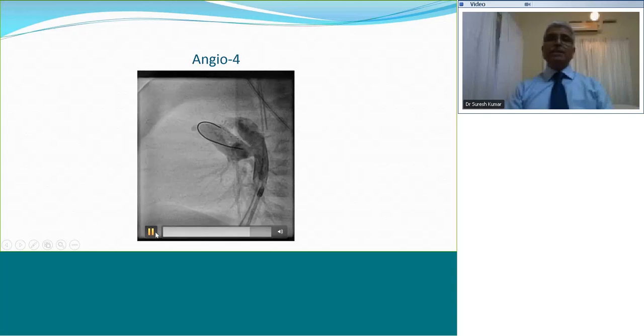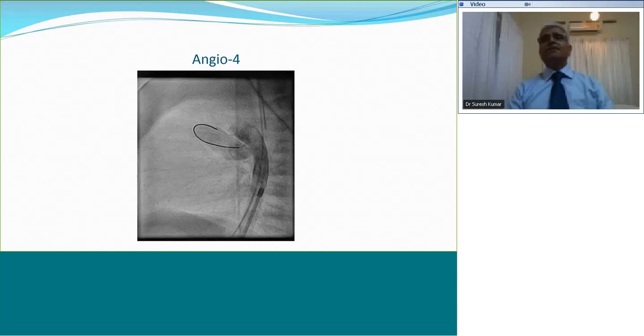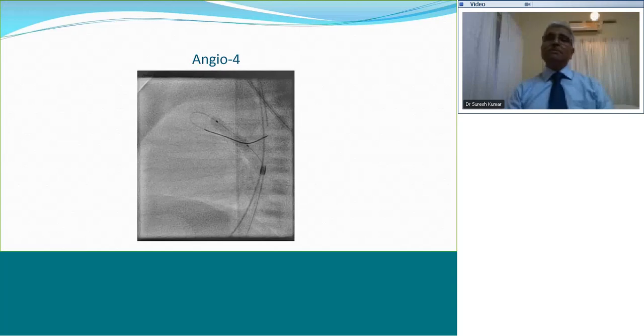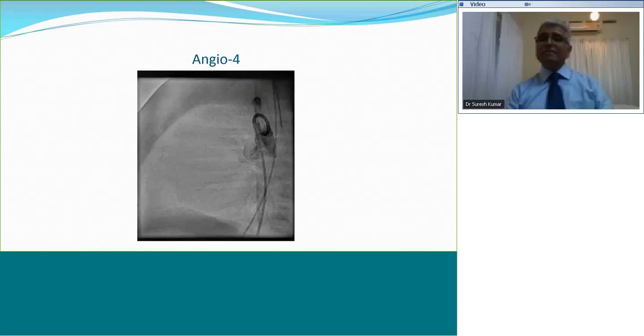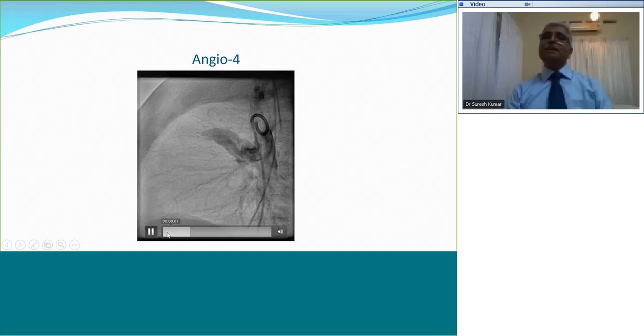I haven't got an answer yet. When do you balloon dilate a PDA? Yes, Sujata, it is PDA stenting.